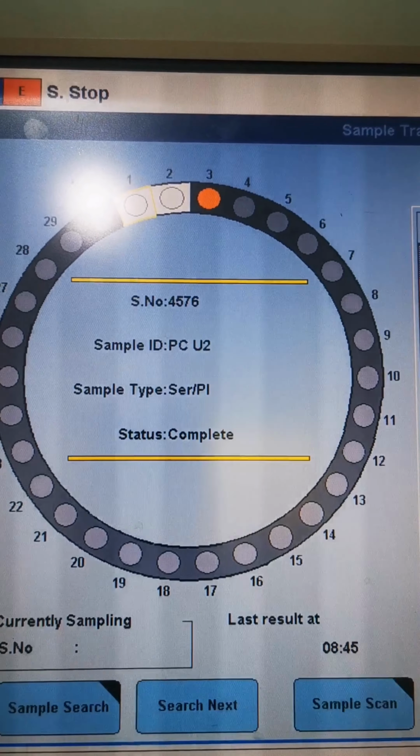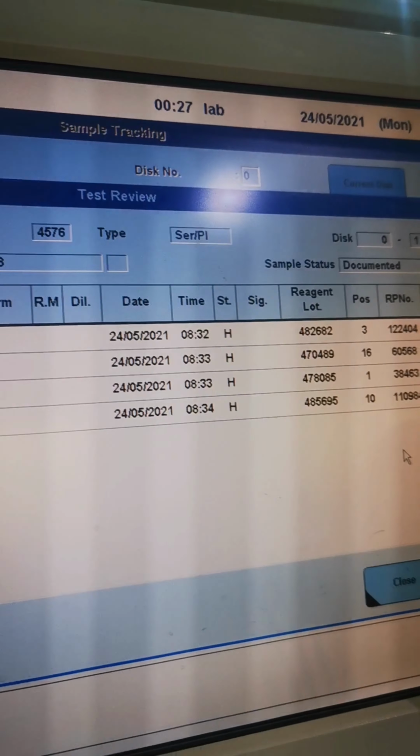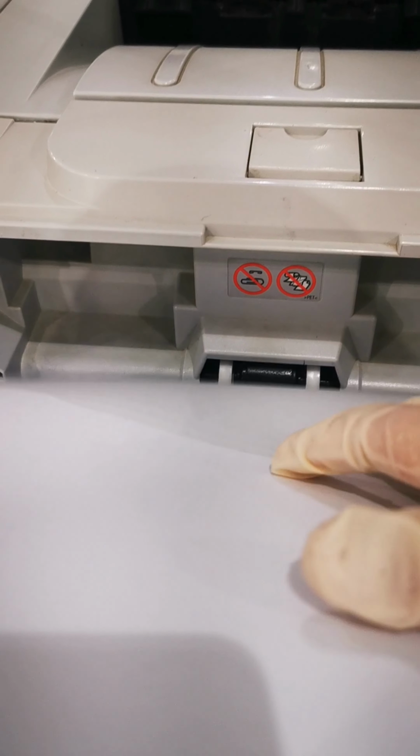So check the result to see if the controls are okay or not. If the controls are okay, you can proceed now to test your patient samples. If not, repeat the control and see what happens to the value.